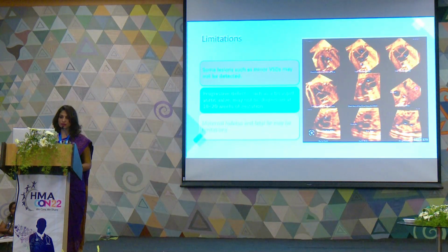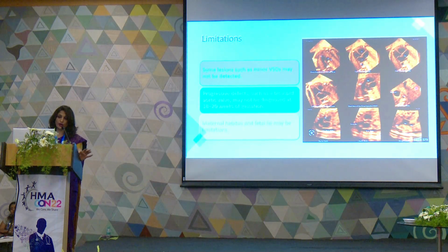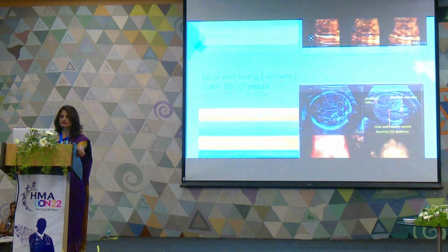It also has some limitations. Some lesions such as very minor VSD may not be detected at all. Progressive defects such as bicuspid aortic valve may not be diagnosed at 18 to 20 weeks or till 24 weeks also. And maternal habitus and fetus lie, obviously there are limitations.